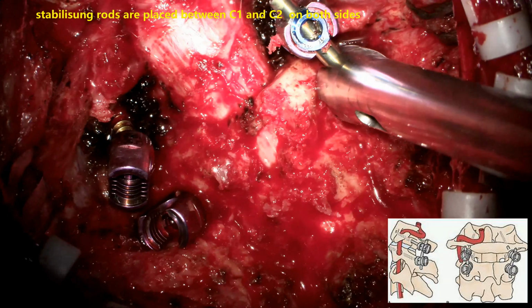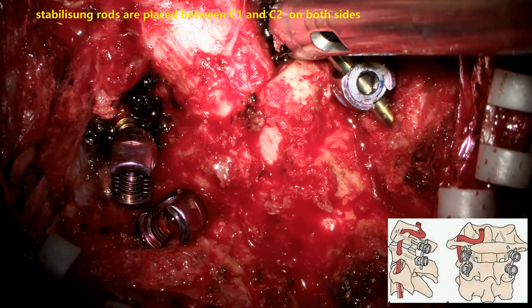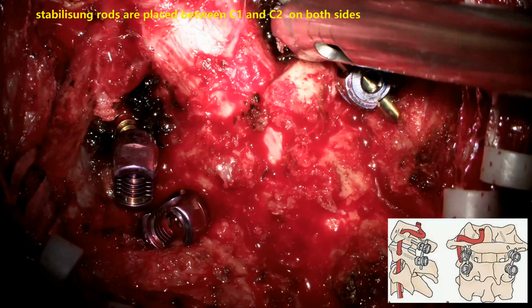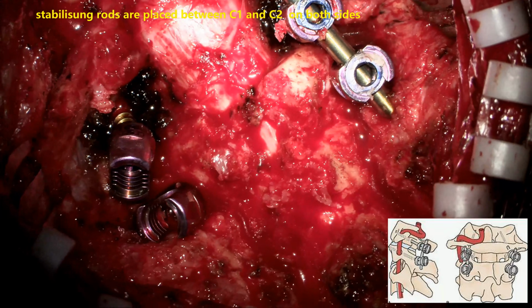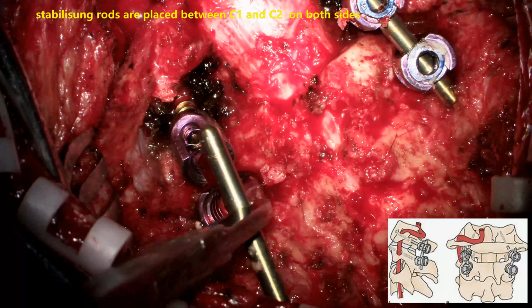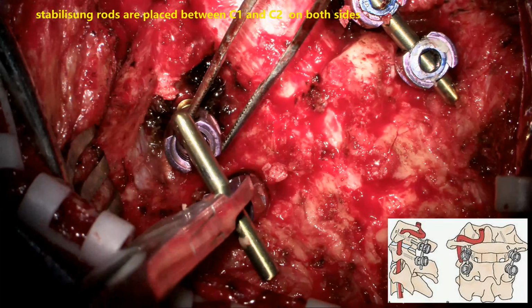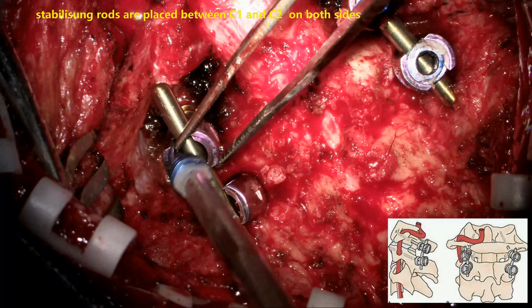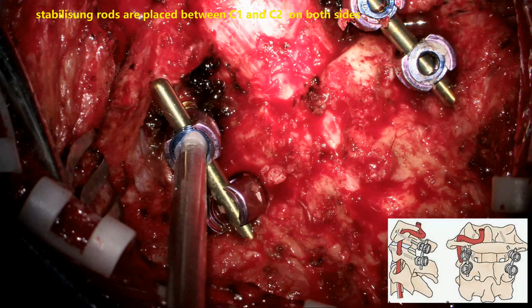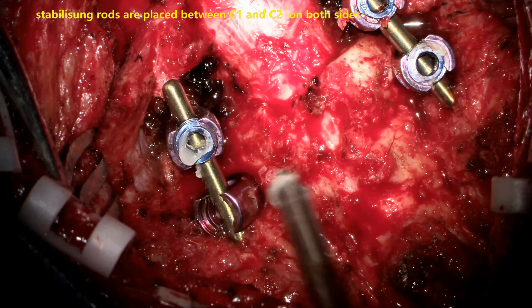Once that is done, the screw head needs to be tightened. At that time, we use the screw head stabilizer so that the screw doesn't move when we are tightening it and doesn't cause loosening of the screw inside the lateral masses of C1 and C2. A similar procedure is done on the left side. Again, the measured length of the rod is taken, keeping 1 millimeter anteriorly, superiorly, 1 millimeter inferiorly. The screws are placed and the rod is fixed, and the screw heads are tightened using the screw head stabilizer.